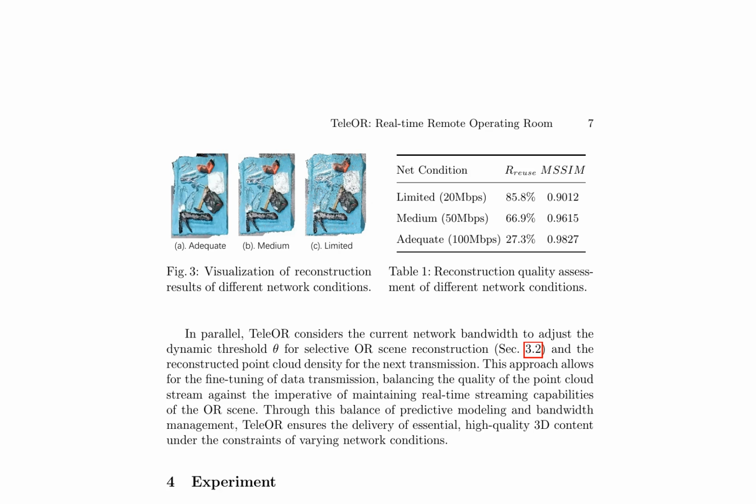TeleOR, a real-time remote operating room system, adapts to varying network bandwidth by dynamically adjusting the threshold for selective OR scene reconstruction and reconstructed point cloud density.